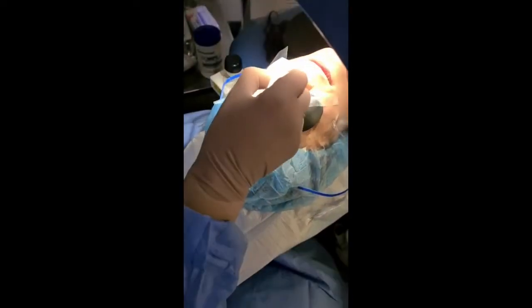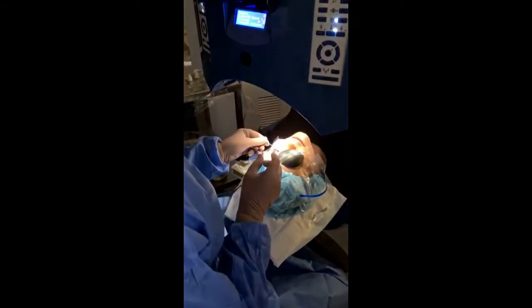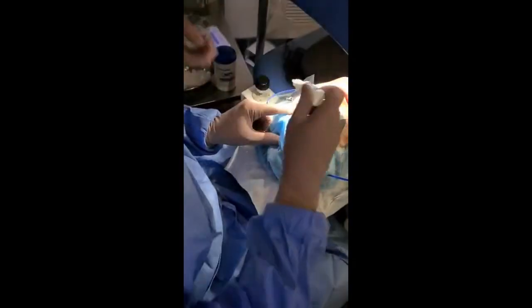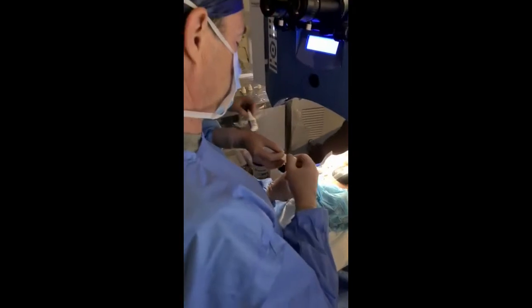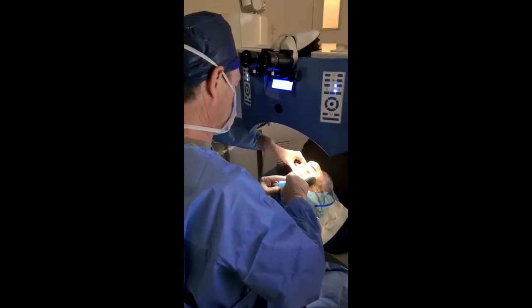A little bit of cold on the eye now — flushing the eye. Eye drop. Now we're going to put a contact lens in your eye. This will make your eye comfortable overnight so you won't feel any pain. Some eye drops for good measure.